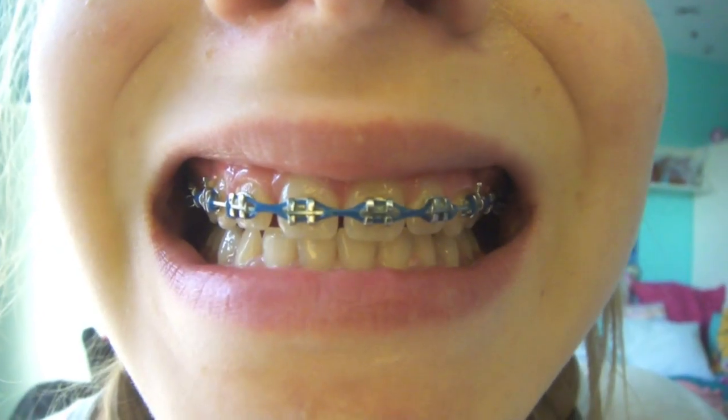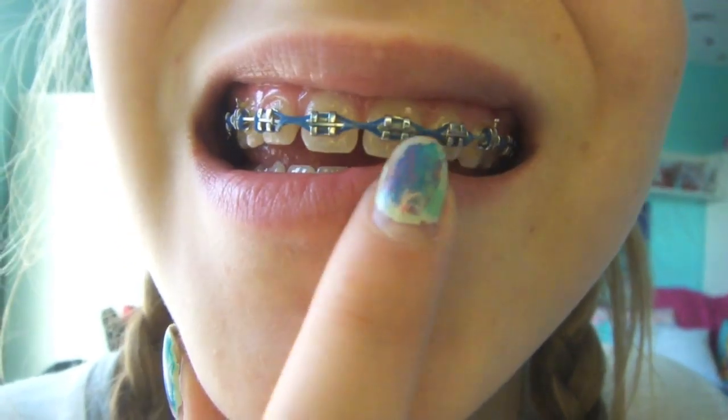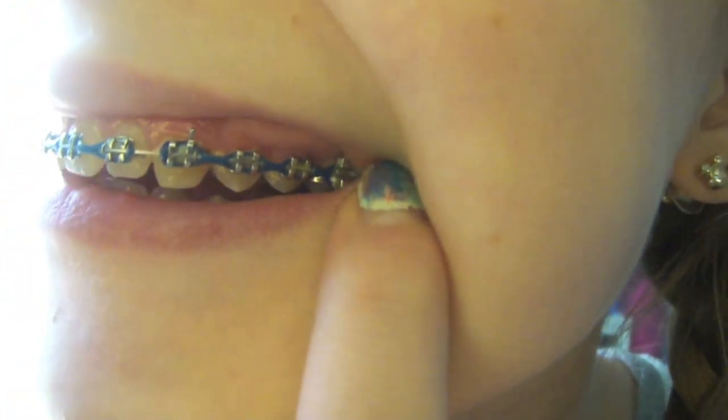Hey guys, so today I'm gonna be making another diary slash journey braces vlog. I just got my power bands. As you can see, it's just like a rubber band, and I have it on these four teeth right here, then there's nothing on that, and then there's some in the back.